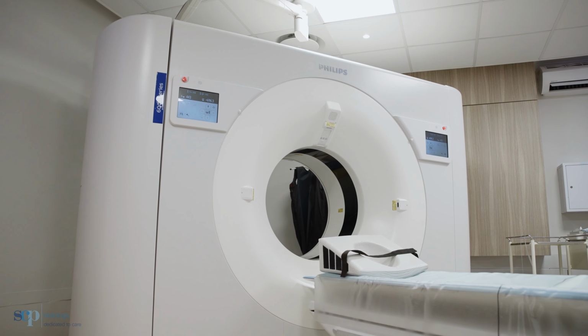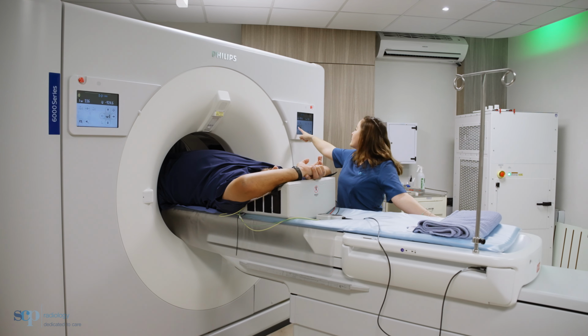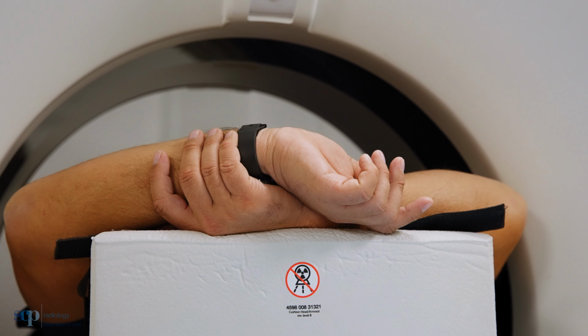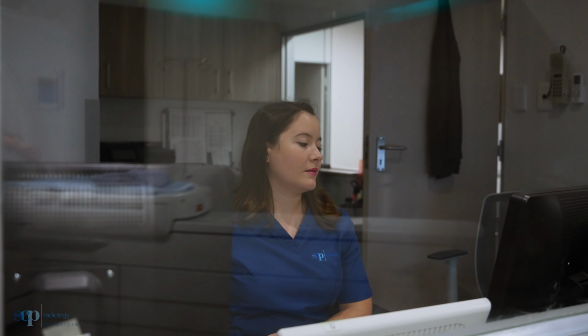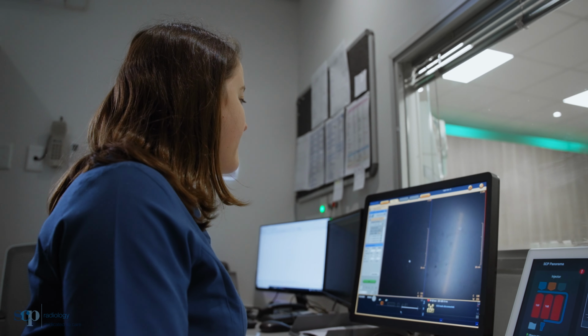So on CT, we get a very good understanding and overlay of the anatomy of the heart. So we can look at the structure of the heart itself, so the different chambers. If need be, we can look at their function, but our main area of interest is really the blood vessels. And we get a very high resolution look at the internal lumen of the blood vessels, and we can see if there's been plaque buildup and whether that's resulting in any significant narrowings.